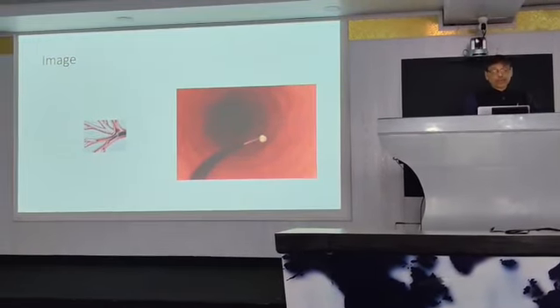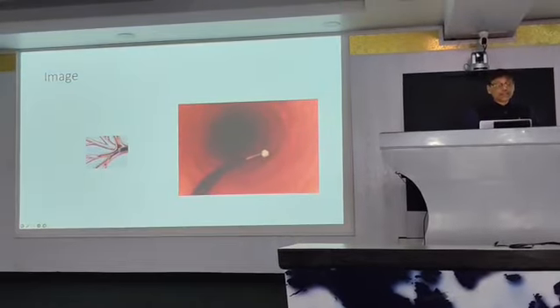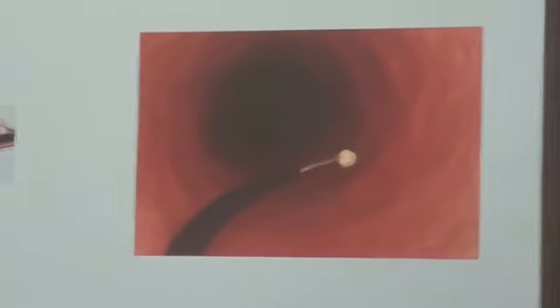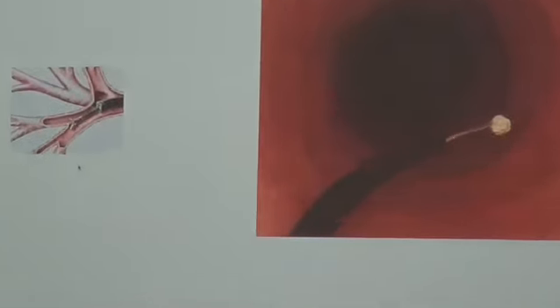So see, this is the endobronchial biopsy. It has been taken. See, this is the forceps. You can see both arms of the forceps. It is opening and it will grab here at the carina, and then we will take the sample.